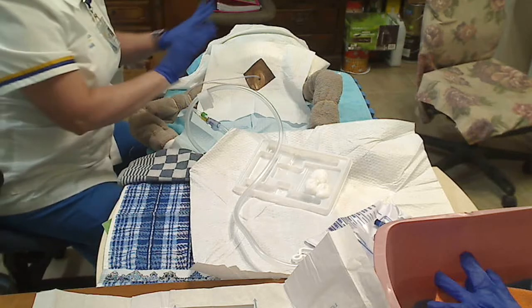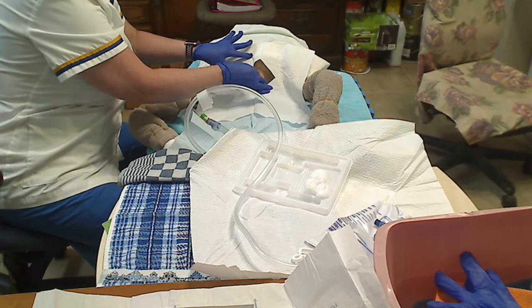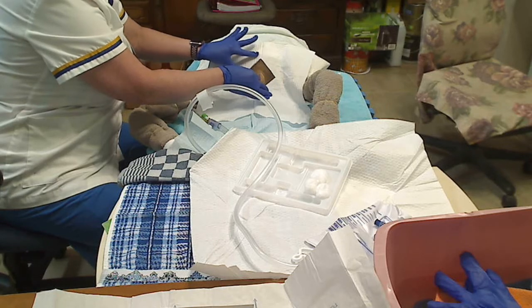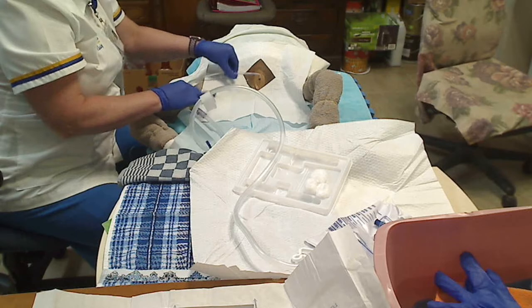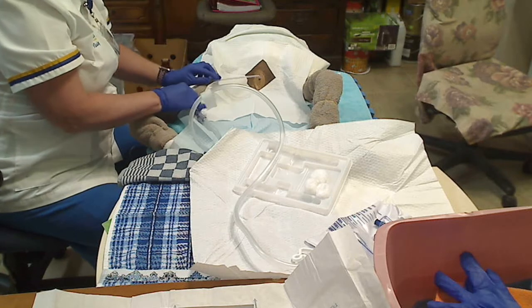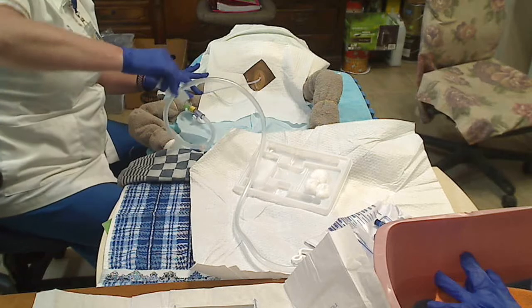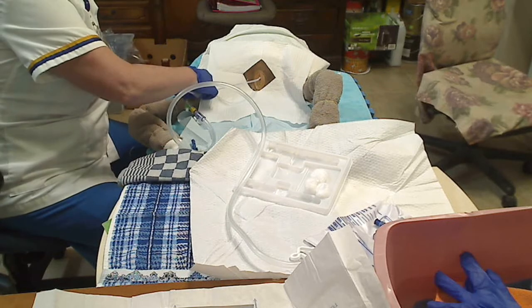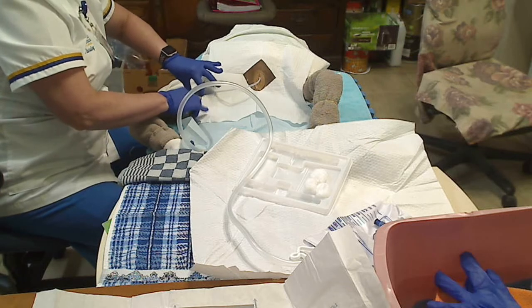Okay, so from here, I'm going to pull back ever so slightly to make sure that the balloon is seated properly on the base of the bladder. I'm going to give enough slack so that she has room to move around without it being tight. I'm going to take my tape and place it just below the Y bifurcation on the tubing.